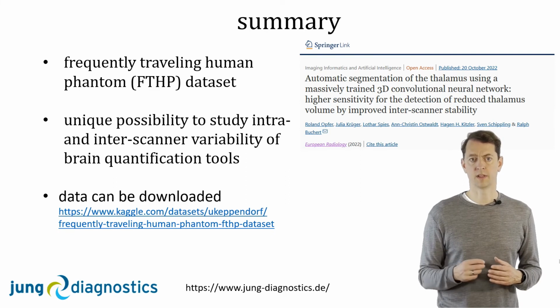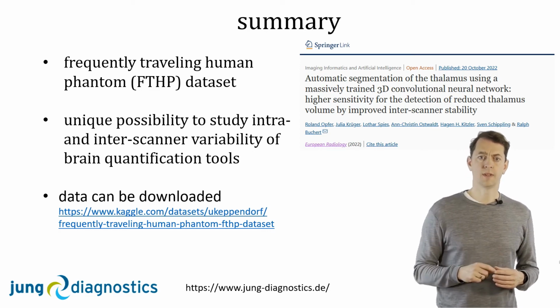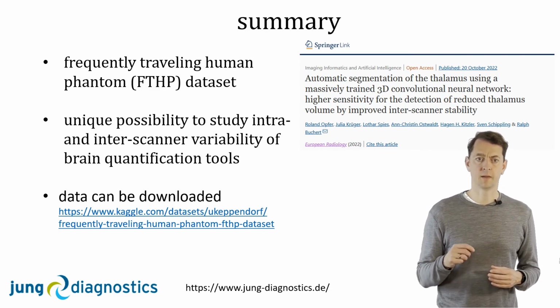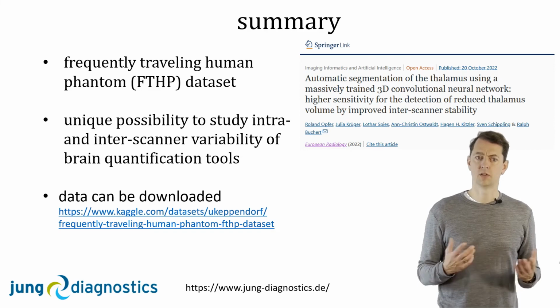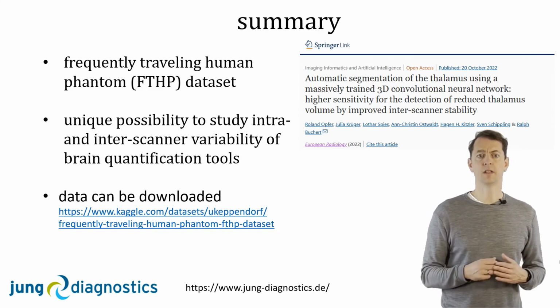The data can be downloaded for free. We formally introduced the FTHP dataset in this publication. So if you want to know details, please follow the link under this video.